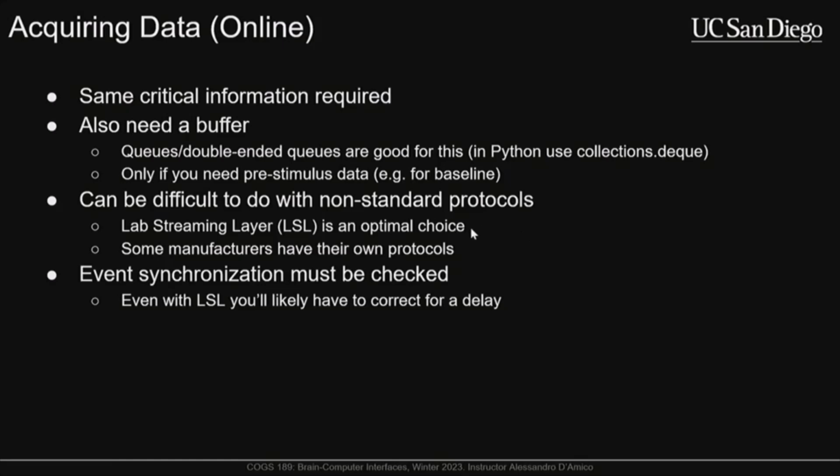And this is something that most manufacturers have supported now because it's very popular. So OpenBCI has support for that. The BrainVision actiCHamp has support for that. BioSemi, Wearable Sensing has it. And what's nice about this is if you write your code to accept an LSL stream, you don't really care what the manufacturer is. Everything is written to accept an LSL stream, so you can have your BCI work with any manufacturer's equipment, as long as it outputs LSL. So this is a very popular and a very reliable choice.